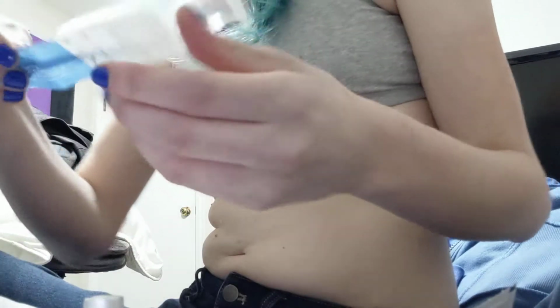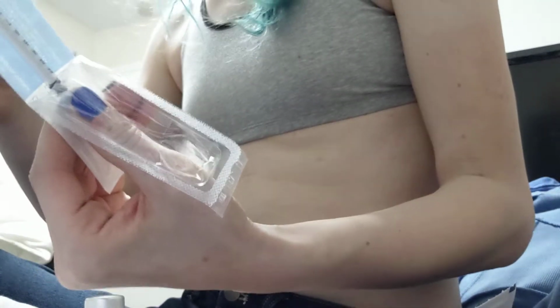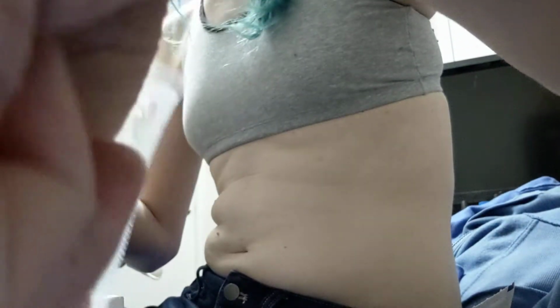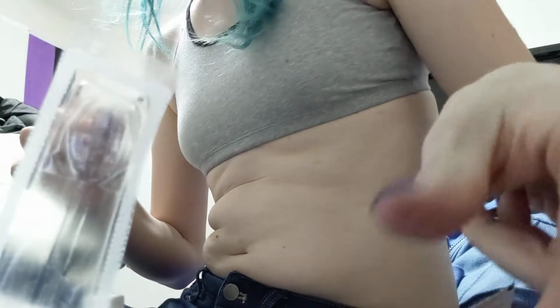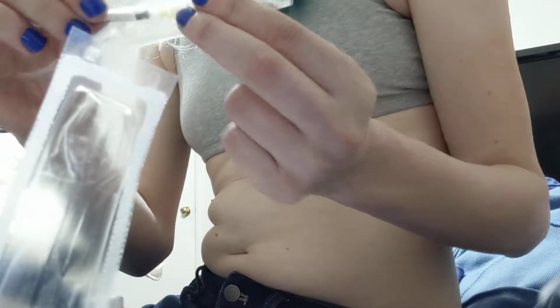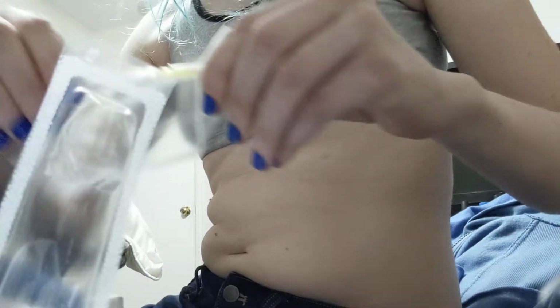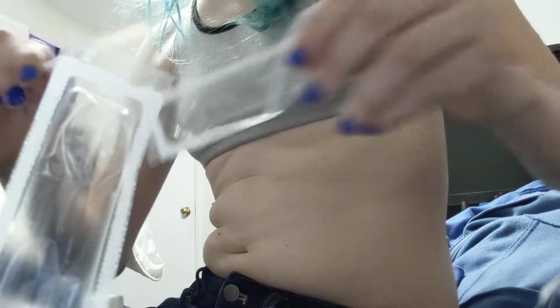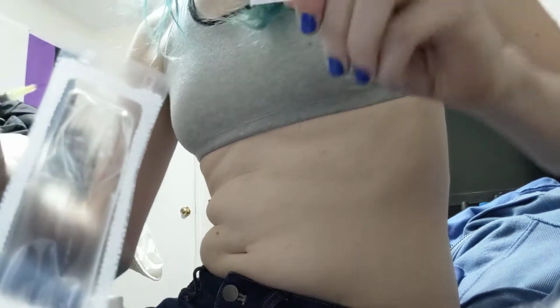Take the smaller syringe with the smaller needle. Pull the small needle off because you will be using it. Keep it in the package. Then you want to stick that larger needle on the small syringe. Make sure that's tight. Then you want to pull off the cap of the larger needle.